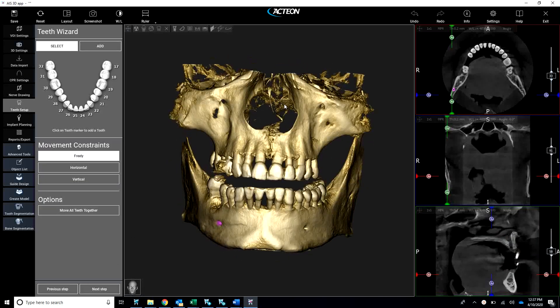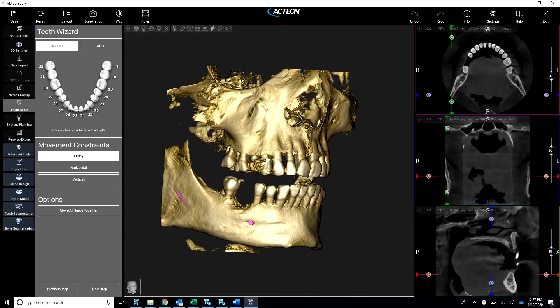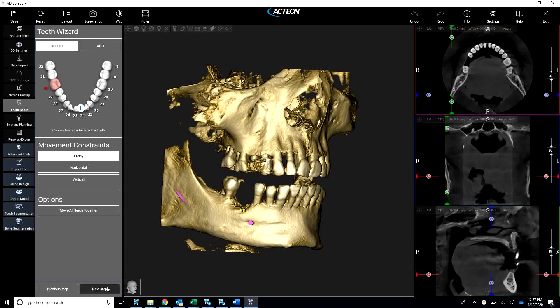Let's go ahead and rotate our 3D reconstruction. Click tooth number 30. As we click, we're going to go down here and click on the buccal plate. It's selected in the area of interest. Go to next step.